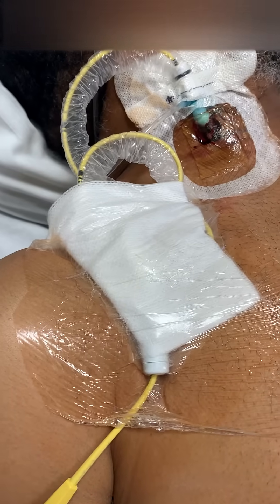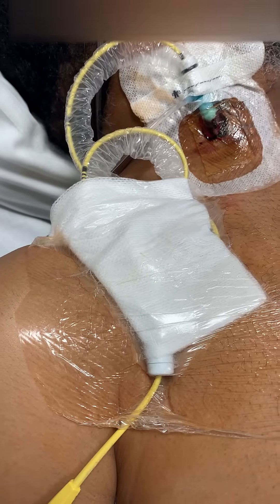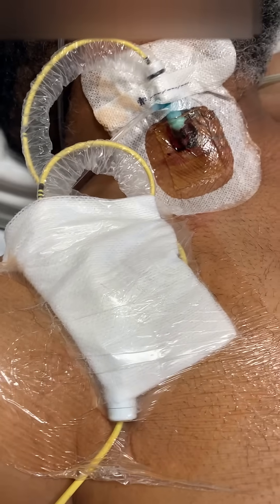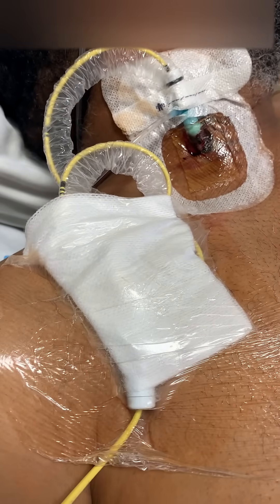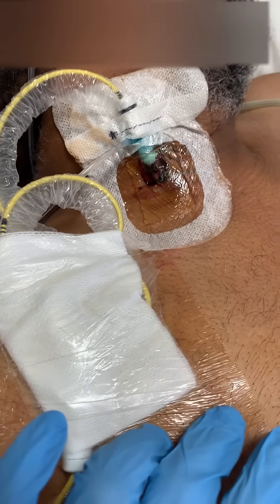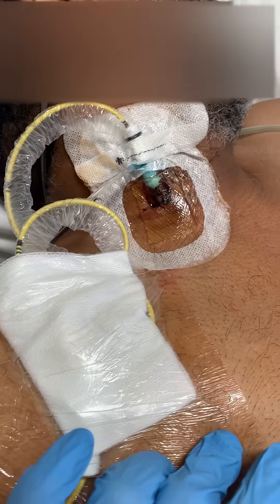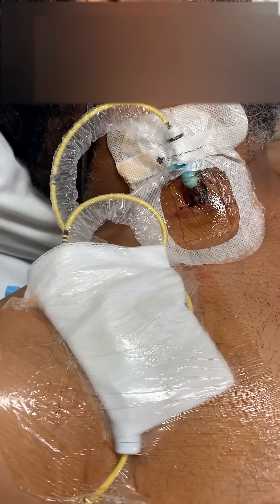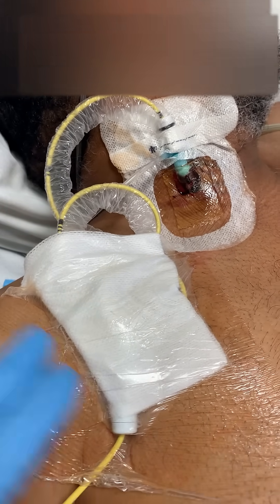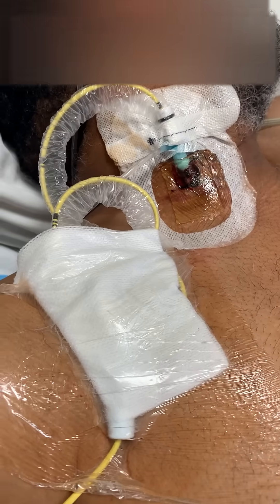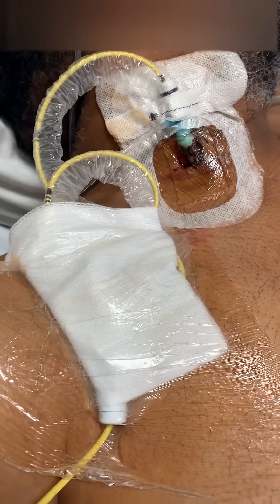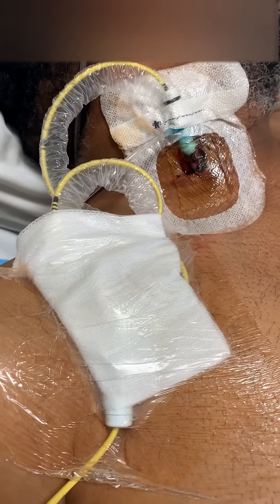This gentleman presented with cardiogenic shock. We placed a pulmonary artery catheter, and today it's going to be removed. Reading the PA catheter, we get numbers for the right side — that's your preload, your right-sided chamber filling pressures.